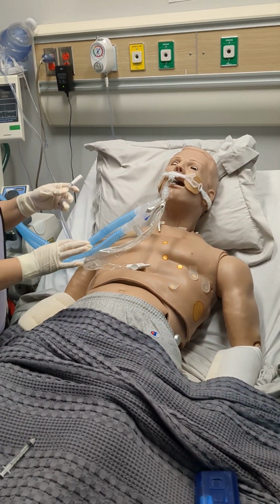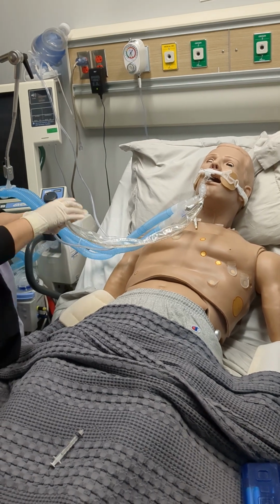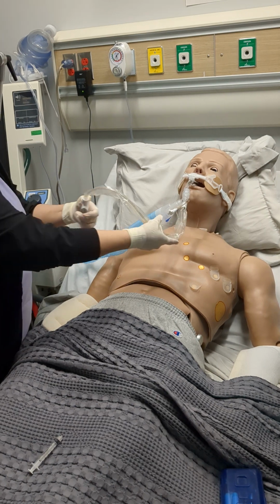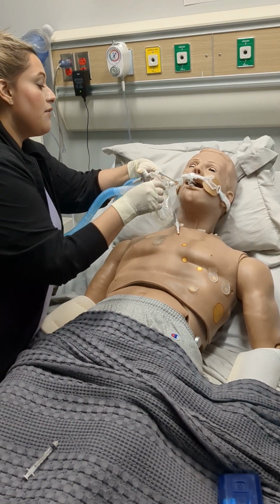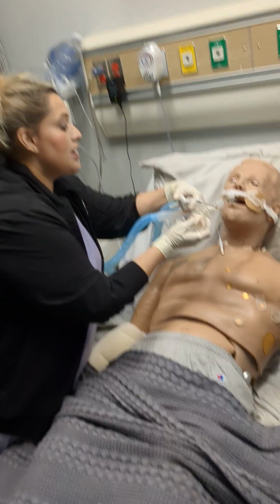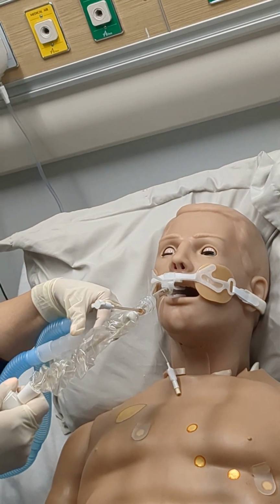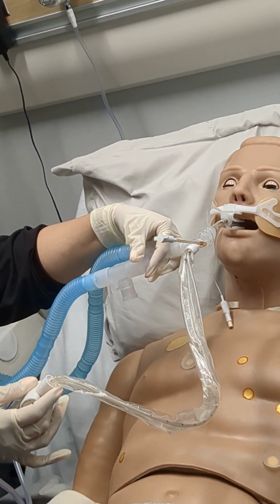All right. Everybody feels good. You grab your pressures, hyperoxygenate your patient, connect your device, you unlock it. You stabilize the ET tube to make sure that you're not moving it around. You advance it until you meet resistance. Pull back 1 centimeter, and now you go ahead and apply your pressure. And then you do that until it's indicated.